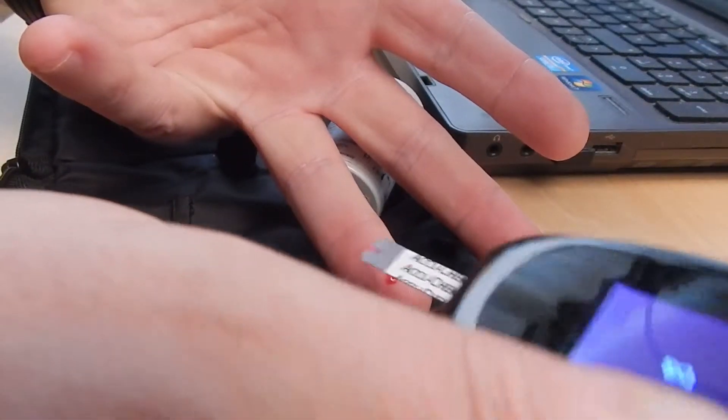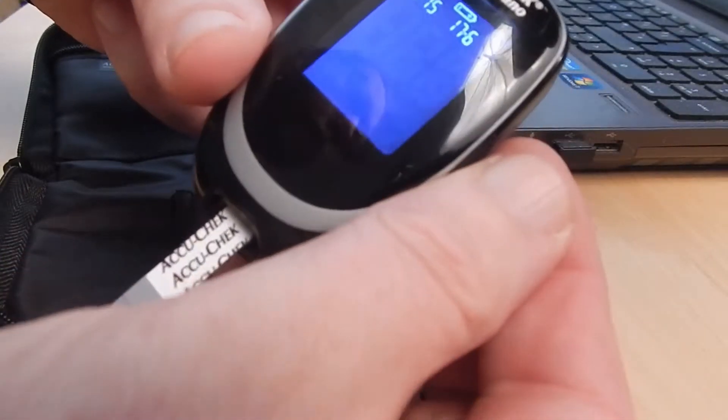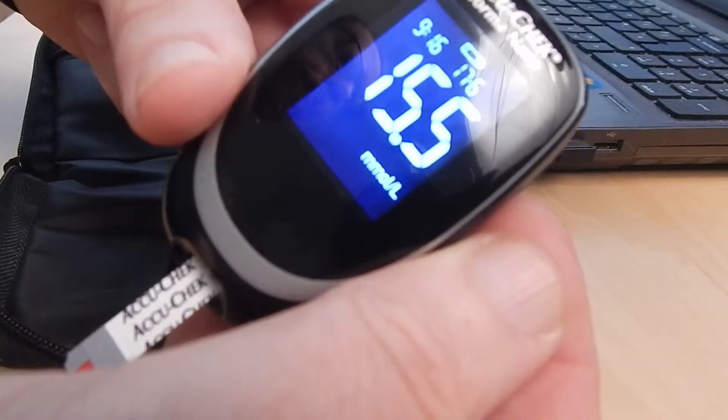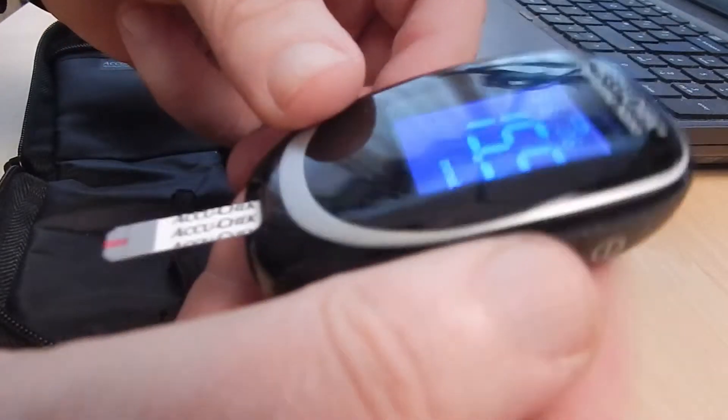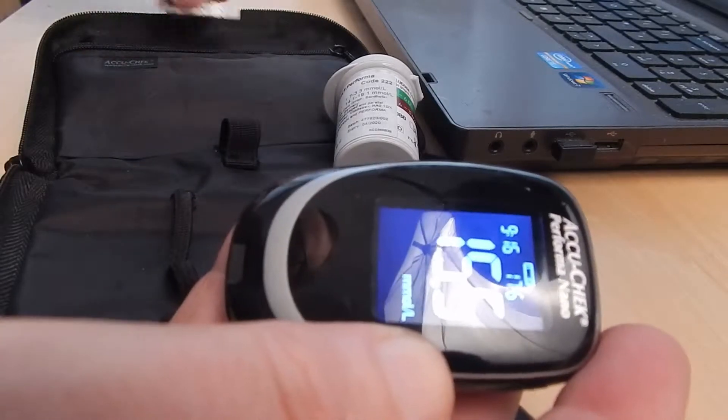The next thing is to dab the blood — you can see it runs onto the strip and then it calculates the blood sugar. This morning: 15.5, which is a better result than I've had for a while.